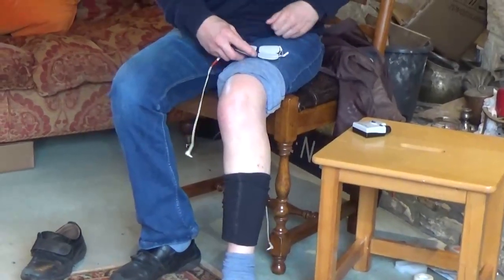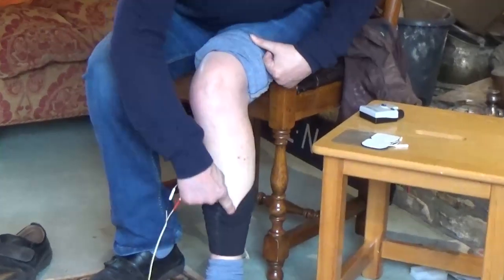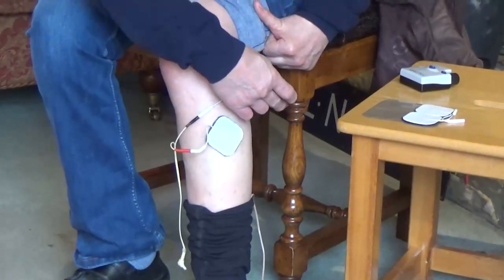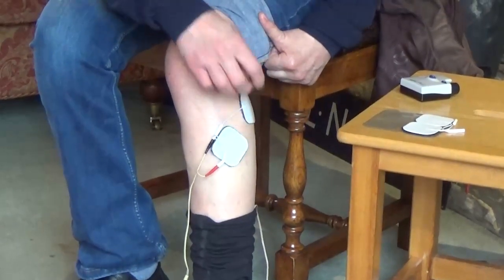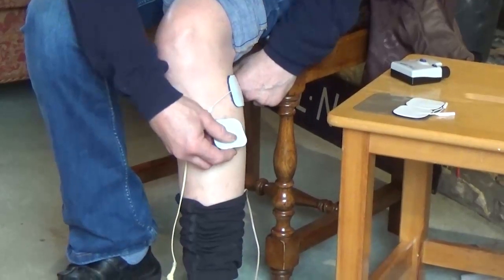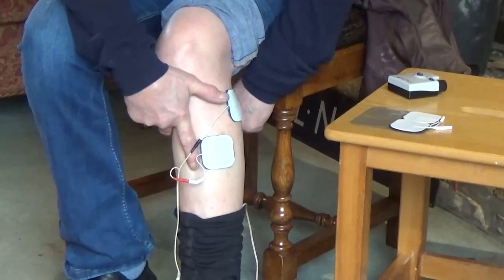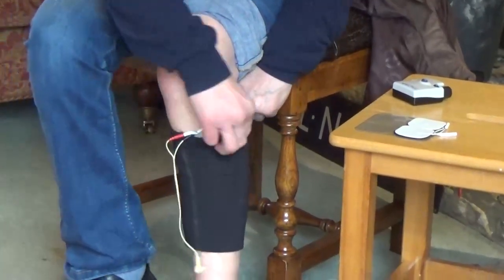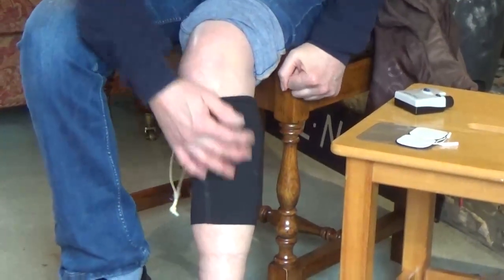I would take the pads and position them first of all by finding the bony top of my bone here — the bony lump there — and put the corner over the top. It's important for me to make sure each corner is well stuck down. Then the second pad is easy to position, parallel to the shin bone, about a finger in from my shin bone there. This little sock is then pulled up over the whole thing and it keeps the wires where I want them and stops the pads from being rolled down with my jeans.